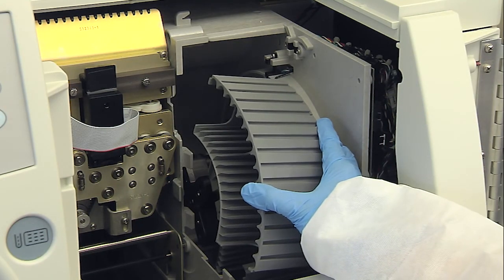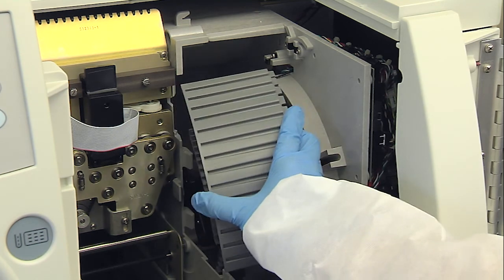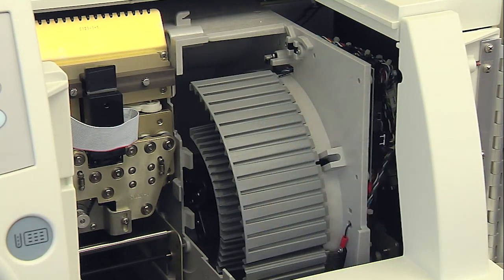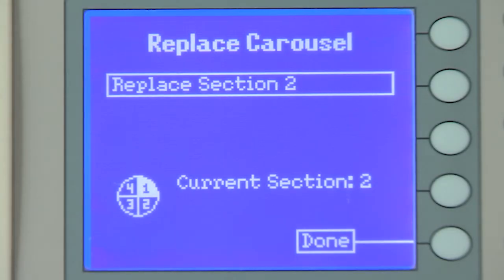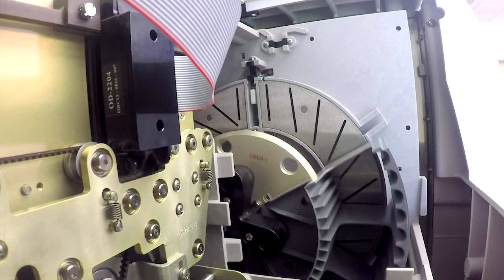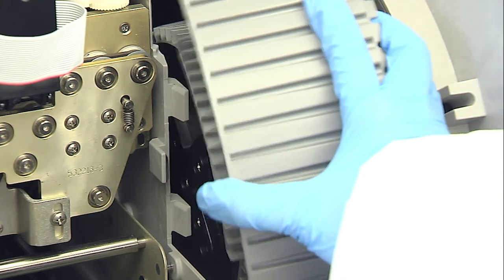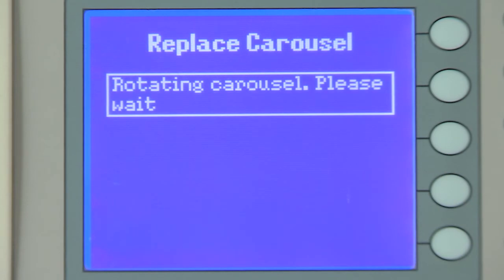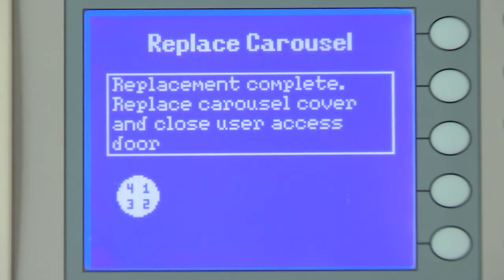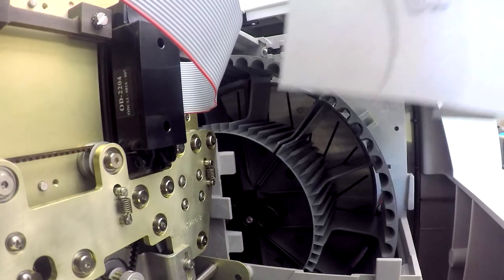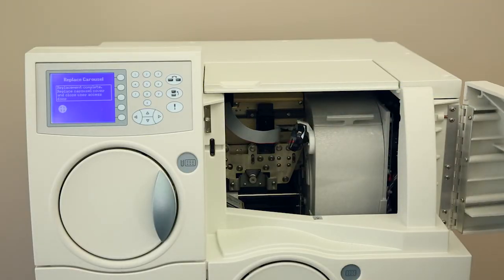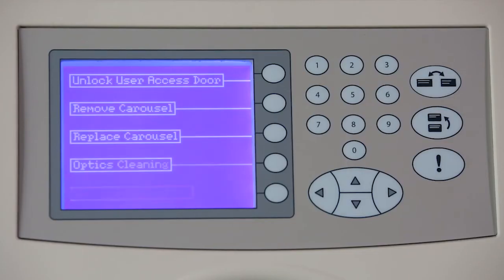Take another carousel section, orient it as described previously, and push it down toward the center of the brass disc located in the center of the carousel. Press the corresponding function key to the right of Done. Repeat this procedure until all four carousel sections have been replaced. Once all four carousel sections have been replaced, the following message displays: Replacement Complete. Replace the carousel cover and close the user access door. Install the carousel cover by sliding it into place, then close the top and front user access doors, after which the Maintenance menu displays.